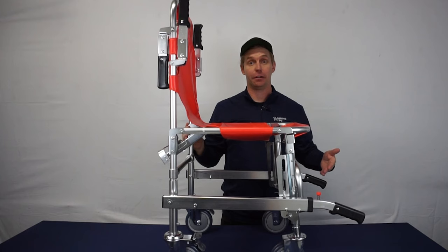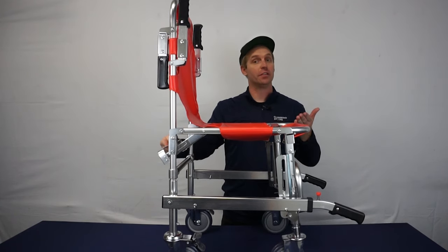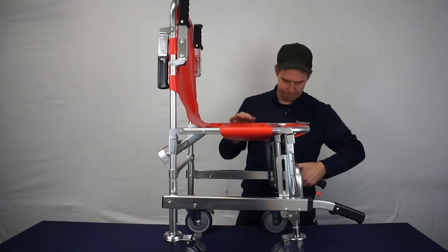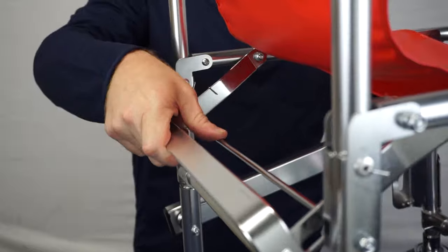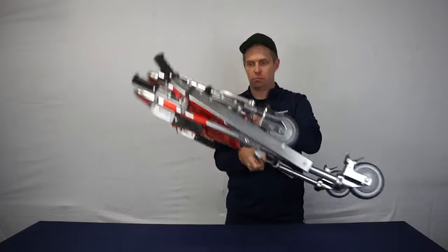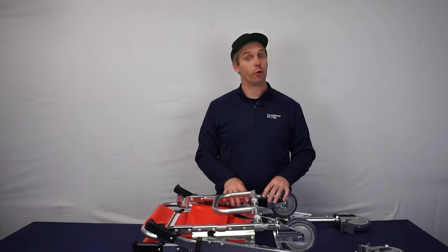The Fold: release the retractable handles and pull up on the release bar located on the back of the chair, followed by pulling the seat upwards. The Hyperlite is now ready to be transported or stored.